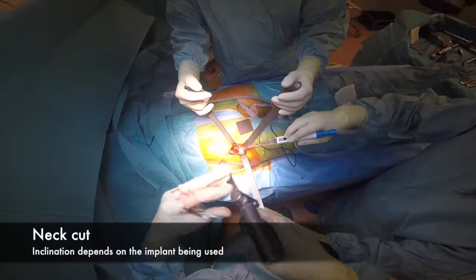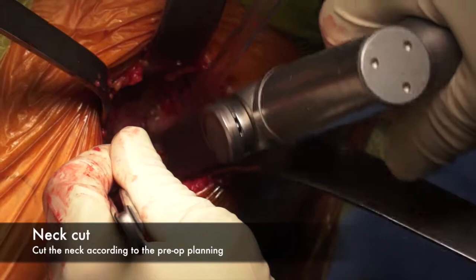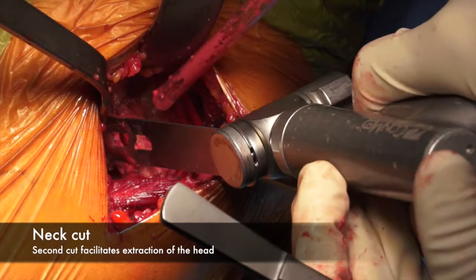2. Neck cut. Inclination depends on the implant being used. Cut the neck according to the preoperative planning. Second cut facilitates extraction of the head.